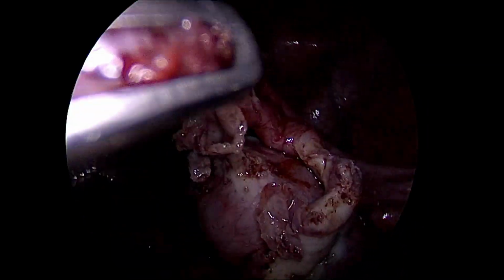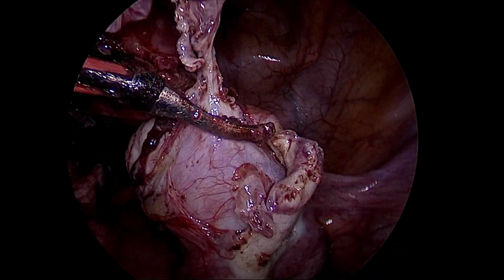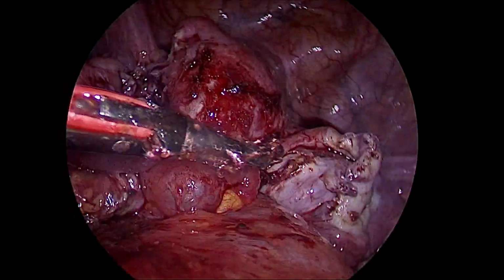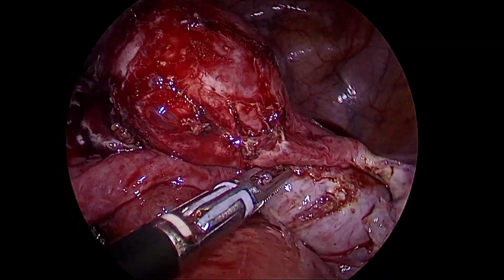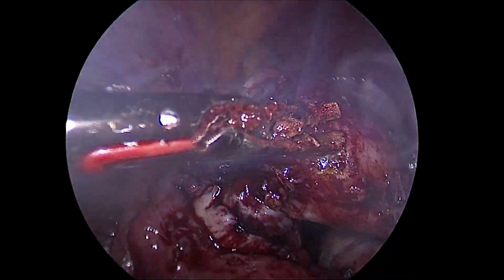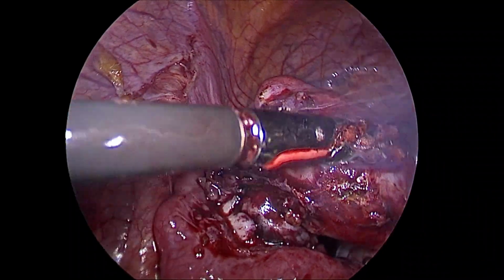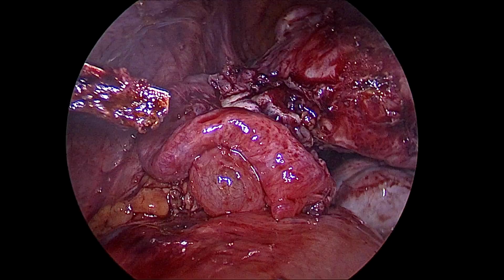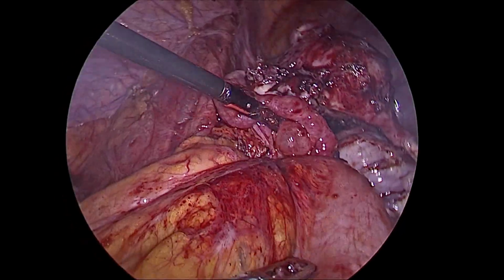Here again there are certain peritoneal coverings over the ovary, there it also goes out. And now after having an almost perfect restoration, we will just be taking care of small oozers with just a micro burst of a bipolar cautery.